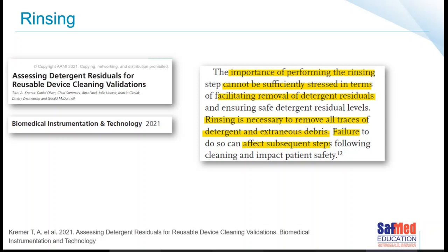So please remember, no matter what chemistry you're using, obviously not if it's an instrument milk, you're following the instructions for use. If it's a detergent, please rinse off carefully. You don't want detergent residuals left inside some poor patient's abdomen.